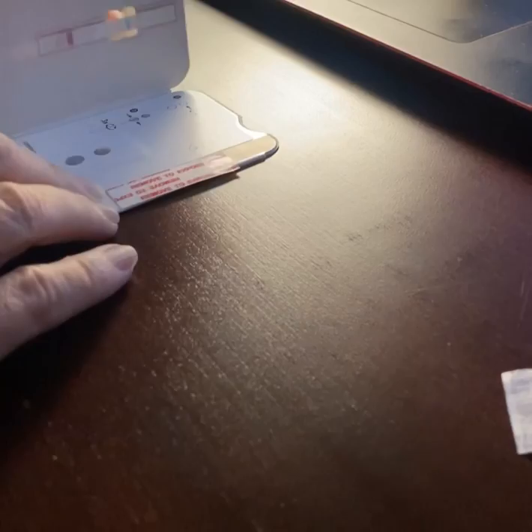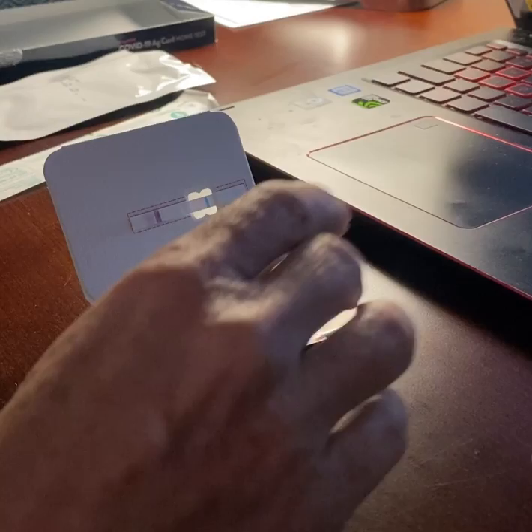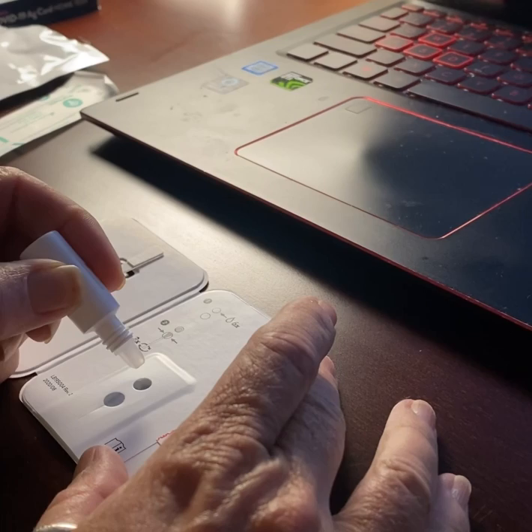Alright, ma'am, now please get the liquid bottle. Remove the cap and hold the bottle vertically half an inch over the top hole. We will slowly add six drops into the top hole of the card. Please let me know, ma'am, when you're finished with the six drops. I'm done.